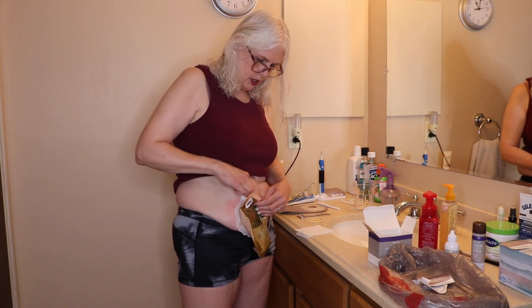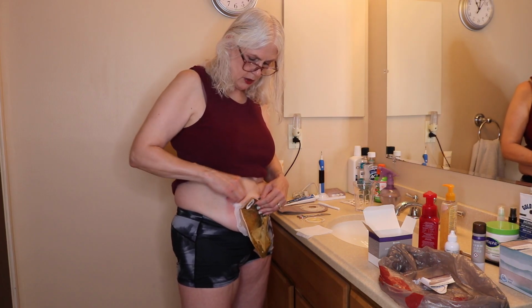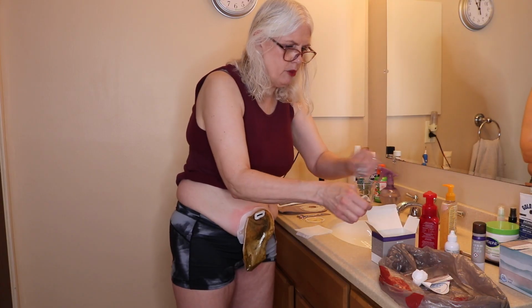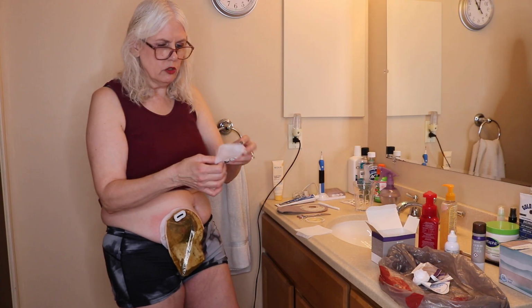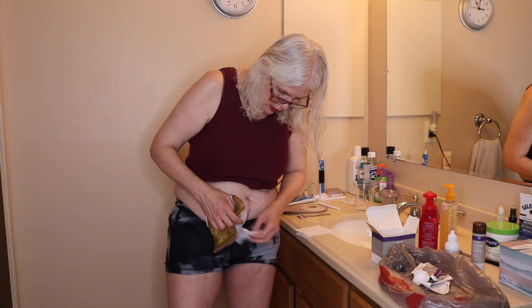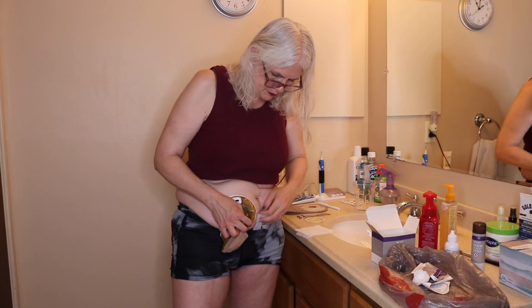In one of my orders, I got 2 boxes of bags. And with that one box that I had been wearing, we put one on and I had a leakage come out the side. And then I changed it. At that point in time, it was shortly, I think, after I had gotten the stoma, I was having my husband help me change the bags and everything. So we changed it to another bag, and again, within an hour, I had a leak again. So I think I changed it in the morning, like at my morning shower, and then it had leaked, so we changed it again.